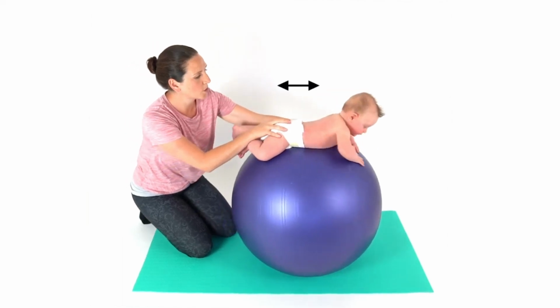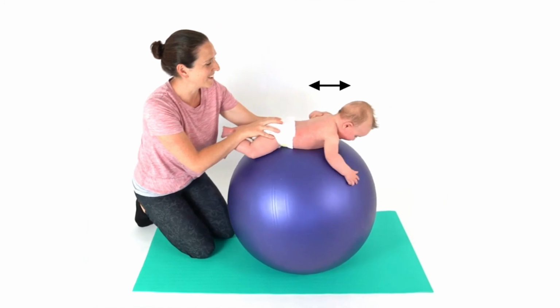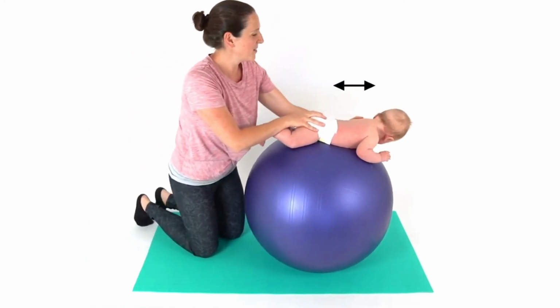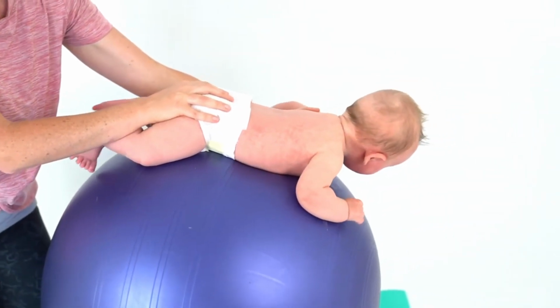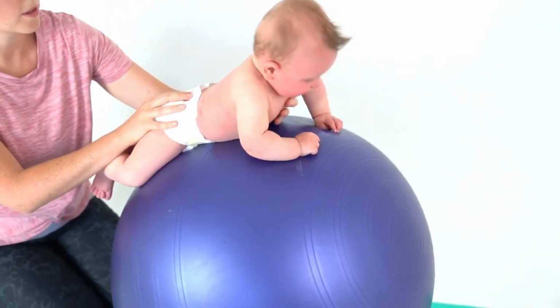For generations, physical therapy for babies born with cerebral palsy has been treated the same way. A trained, professional physical therapist would set them down on a yoga ball and tilt the ball in various directions to get the baby to activate its core muscles. However, the effectiveness of this treatment is heavily reliant on the ability of the physical therapist.